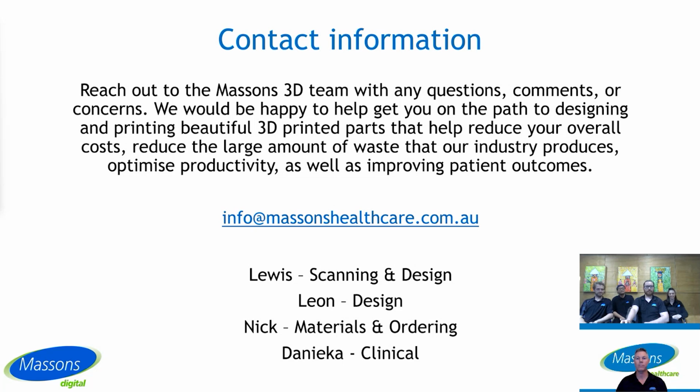So we currently have, I'm going to say, the equivalent of the H2 scanner. I don't think it's as new as that one, but we've got that in our department. I'm at the Alfred. And we are using it a lot for facial work, mostly for faces, for burns, face masks, but also I think we've done a few AFOs with it.